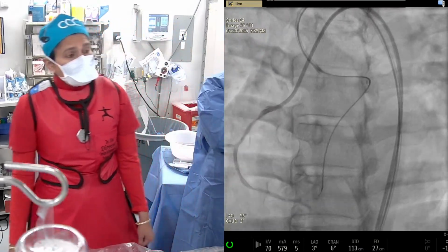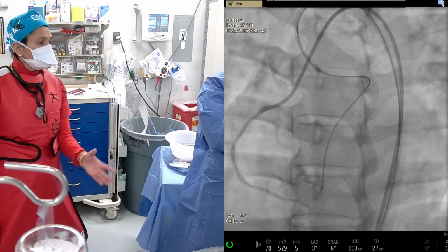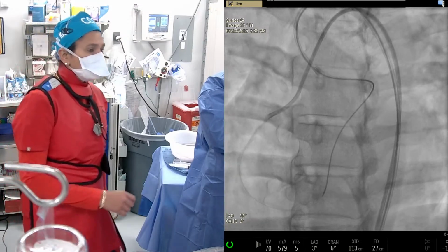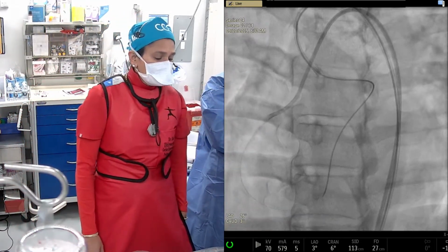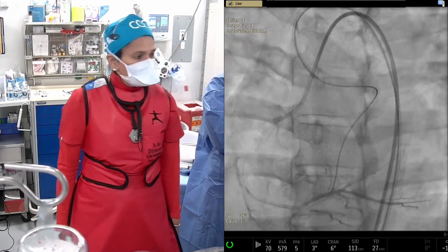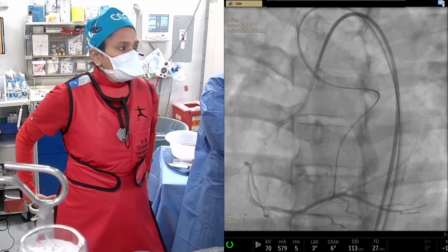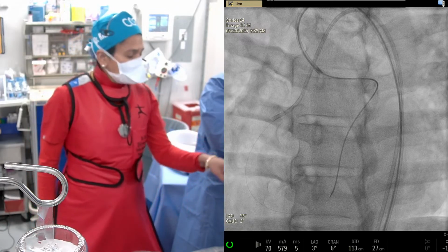After that, you do externalization, which I think we can only watch on the video. When you do externalization, that means once the Corsair is in the guide, you remove whatever we used of Miracle, take it out, and the 330 wire, whether it is RG3, RG330, you go through the left side and come out of the right side.